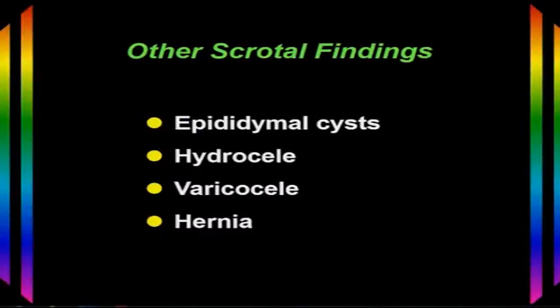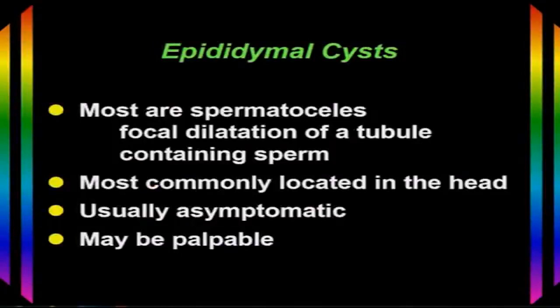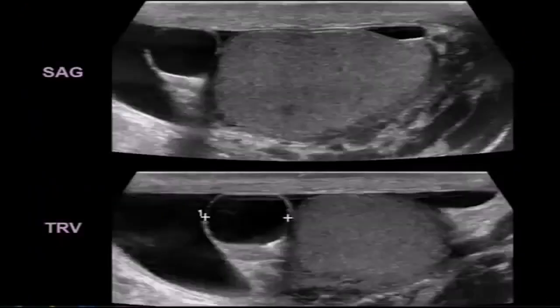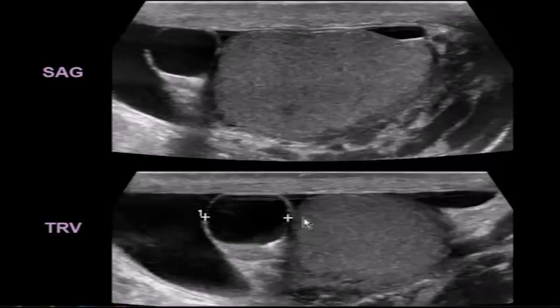Besides the testicle, we look at other things in the scrotum including the epididymis and the scrotal sac, looking for fluid from a hydrocele, a varicocele, or even a hernia. Epididymal cysts and spermatoceles are typically located in the epididymal head, representing focal dilation of tubules carrying sperm. They're usually asymptomatic but may be palpable. Here's a patient with an epididymal head cyst — the testicle is normal, but above it is a well-defined anechoic cyst with thin smooth walls.